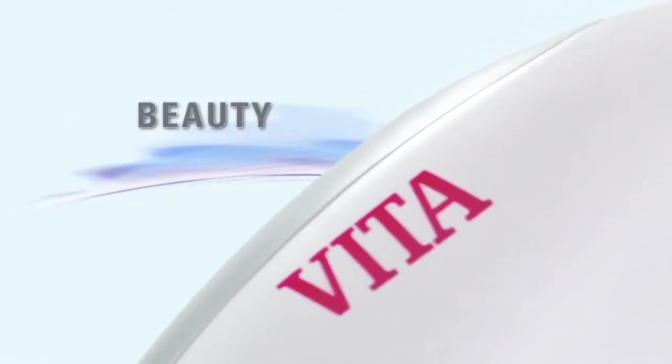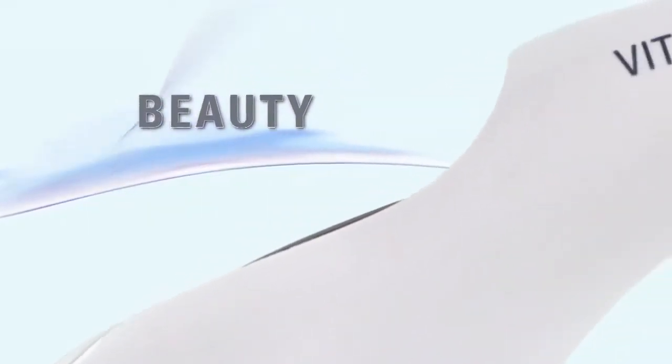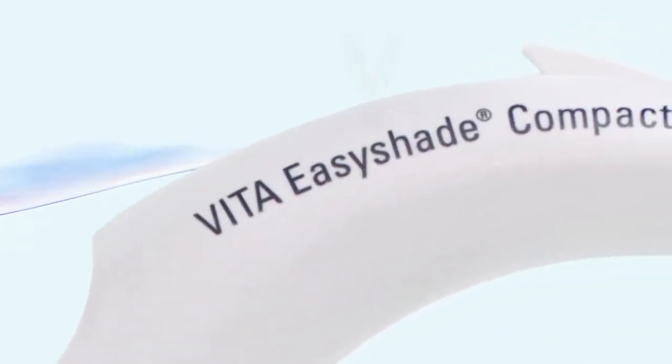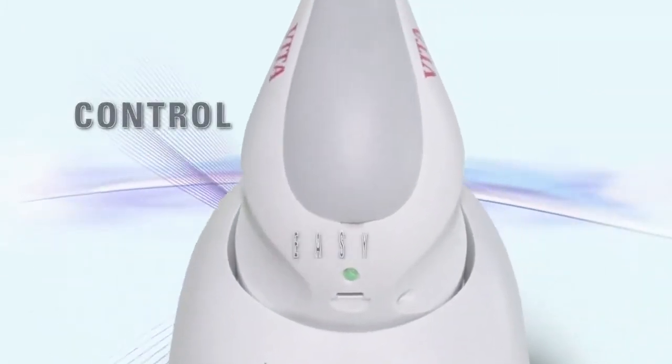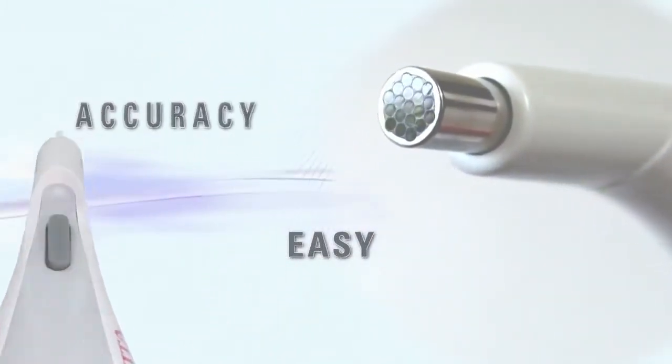Beauty, it has been said, is in the eye of the beholder, but sometimes it can be found in the palm of your hand. The Vita EasyShade Compact elevates the art of shade matching to new levels of control, ease and accuracy.